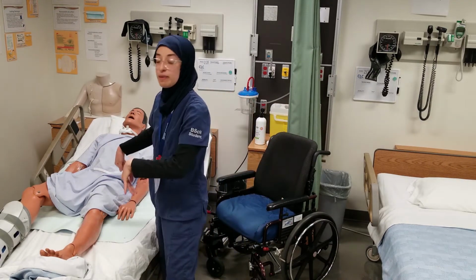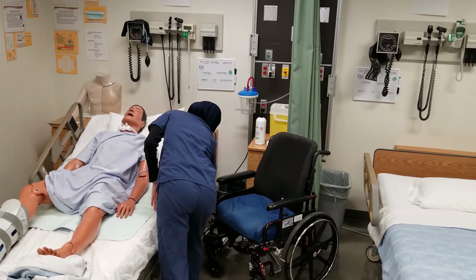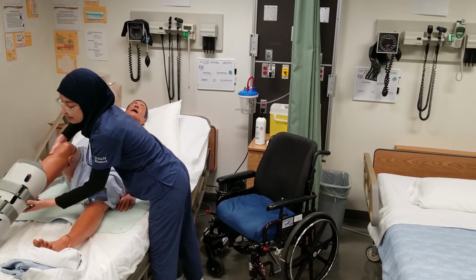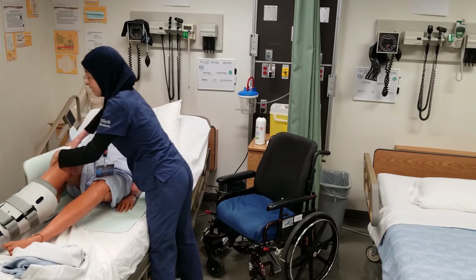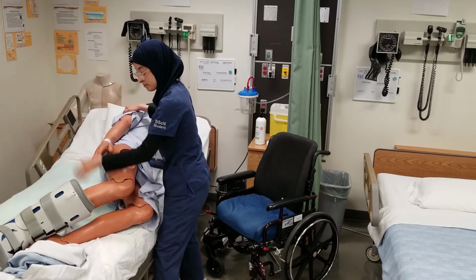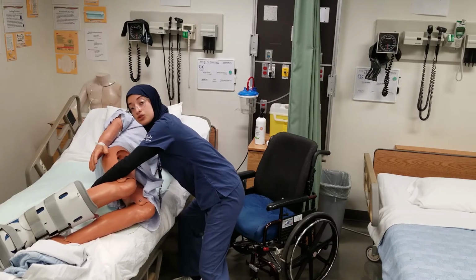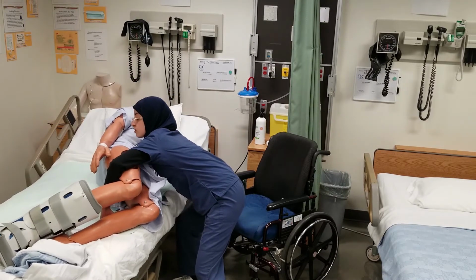So I'm going to go ahead and turn my patient onto the side. I'm just going to raise the level of the bed slightly so that I'm not straining my back. I'm going to bend the patient's legs to make it easier for me, and then I'm going to grab onto the bed pad and turn the patient right onto their side. Again, I'm going to place one hand on the thigh and then one hand underneath the shoulder, and on 3, I'm going to swing and I'm going to shift my weight to the back leg. So ready? 1, 2, 3.